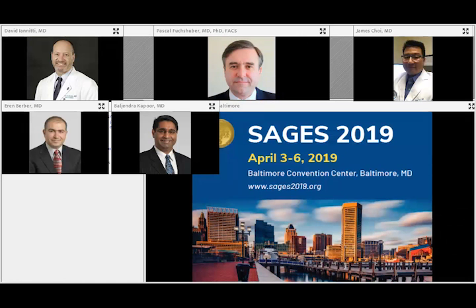For 2.45 gigahertz, that's going to be about 1.5 to 2 centimeters. So if you're trying to preserve something like a bile duct or a vessel, or the heart or something close, you need to park your antenna off that tissue. You can't do what they do with water hydrodissection, which is an insulator, because it doesn't work. You need physical separation to get out of the microwave near field. Then you can play with conductive heating. And there are a couple of other tricks in terms of shielding. You can put a malleable next to the pericardium over the liver, and it'll reflect the wave, so the wave won't go through. So shielding is another option.